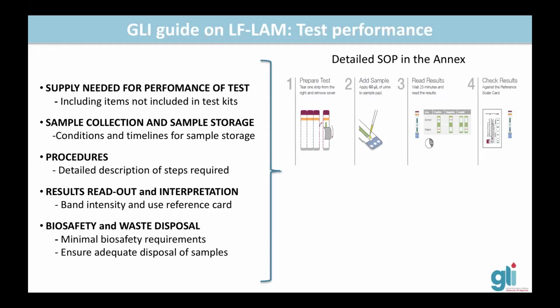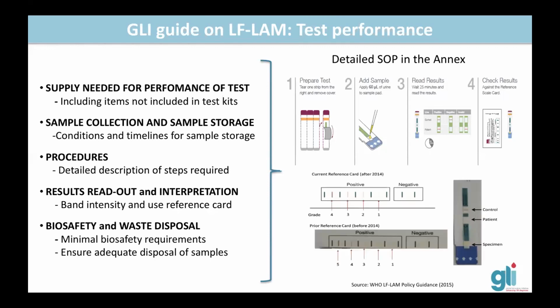We also discuss in the guide the results readout and interpretation, with the importance of using the reference card to support the correct interpretation of the results, as well as the biosafety and waste disposal.